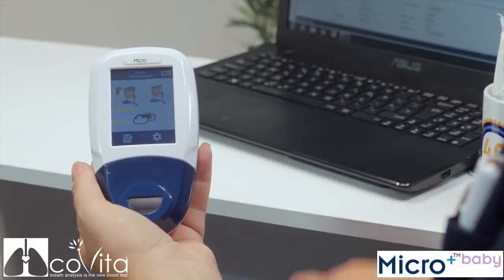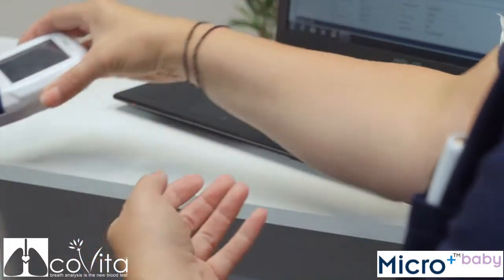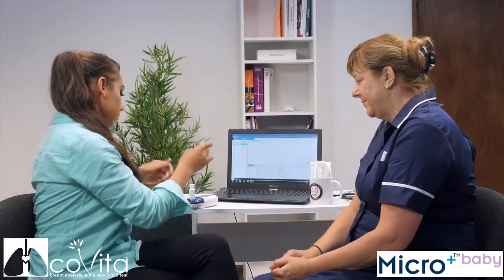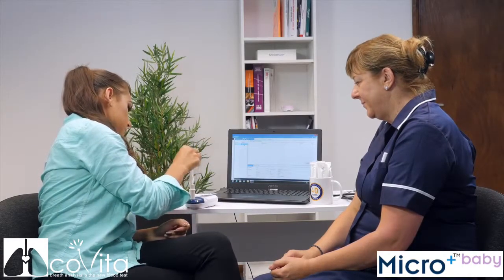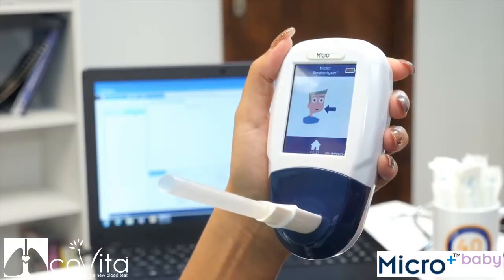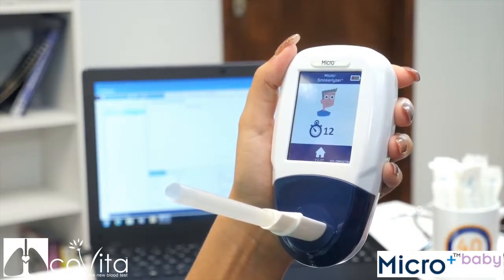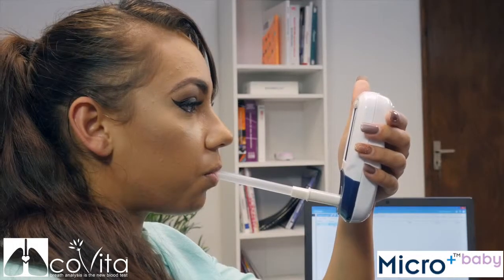To take a normal breath test with the Micro Smokerlyzer, first attach the D-piece to the monitor and then the SteriBreath to the Micro. Click on the normal breath test icon to begin. You will be asked to inhale and hold your breath for the preset 15-second countdown before slowly blowing into the Micro.